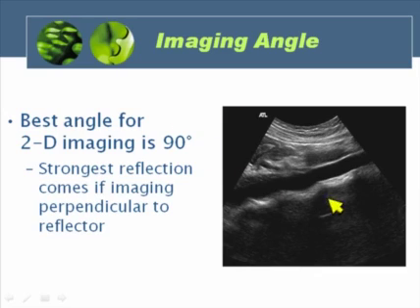Let's look at this aorta. Notice in this aorta, in the distal aorta, I'm able to see a strong aortic wall. However, when we go more proximally, I lose this aortic wall. Why did that happen? What happened to the aortic wall in this location? Well, the curvilinear transducer, remember, sends out all of its scan lines along the shape of the transducer. So this scan line coming out this way is 90 degrees to the plane of the aortic wall, and therefore this shows up as a bright white line or as a specular reflector. However, these scan lines that are coming in this direction are not 90 degrees to the aortic wall and therefore do not send a strong reflection back to the transducer.